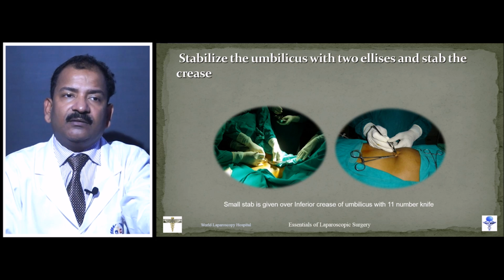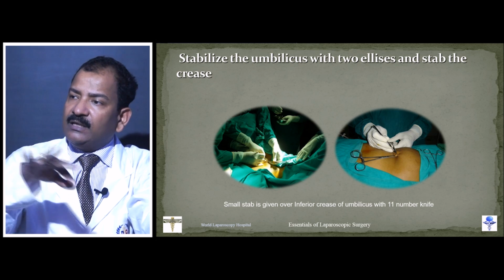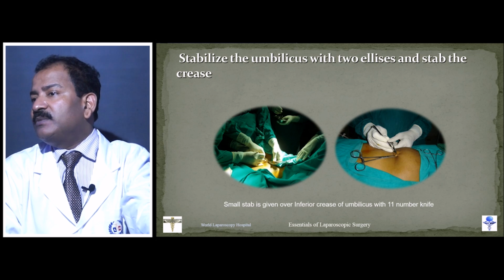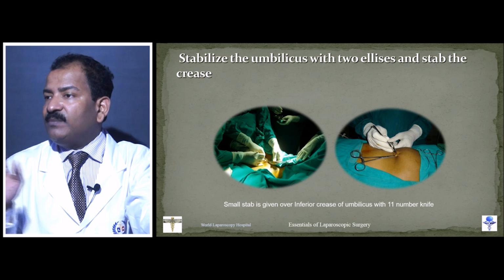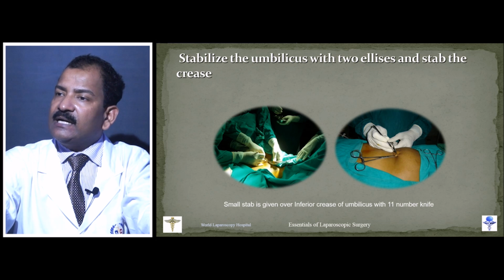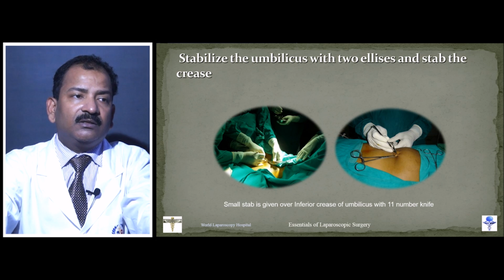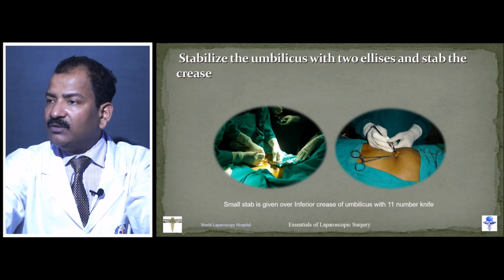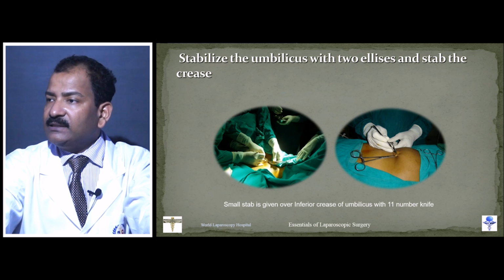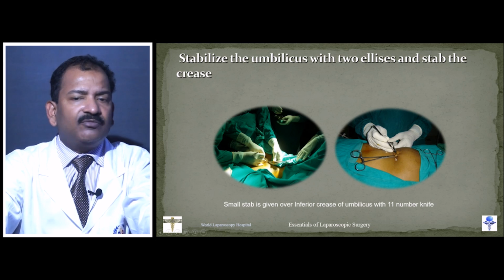Ideally, it should be avoided, because if you cut an 11 mm incision, or cut the rectus, or go too deep, then your quadromanometric indicator will not be good, because 50% of the gas is leaking outside, and that will not help you to decide whether the minimum amount of the required gas is filled in the abdomen or not. So, even if 8 liters of gas go inside, your abdomen will still not be distended, because 50% of the gas is leaking. That is why initially we should give only a 2 millimeter stab wound.